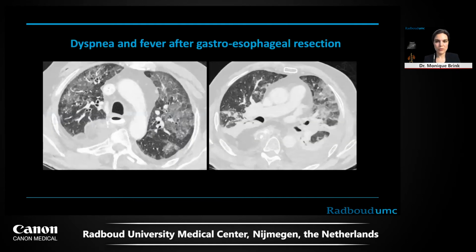And now we're going to the third and final patient. This is a patient who underwent a gastroesophageal operation and who had dyspnea and fever after that with a high clinical suspicion of COVID-19, as this patient was exposed to patients with COVID-19. And what we saw is bilateral ground glass on the CT, which was made with intravenous contrast, also to exclude post-operative complications. And this patient was given a CO-RADS 4 because there were some atypical features as well. But the patient never got a positive PCR or other signs of COVID-19 in the course of the disease. So this was a false positive CT.